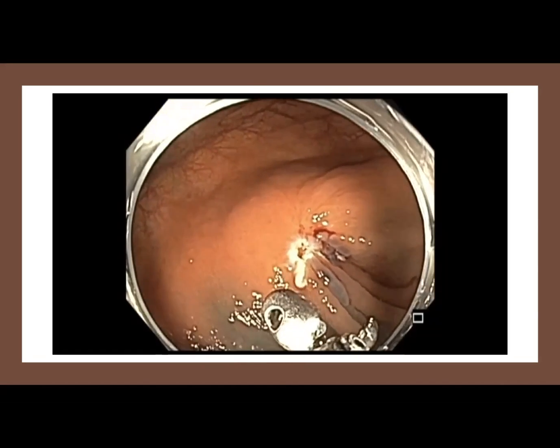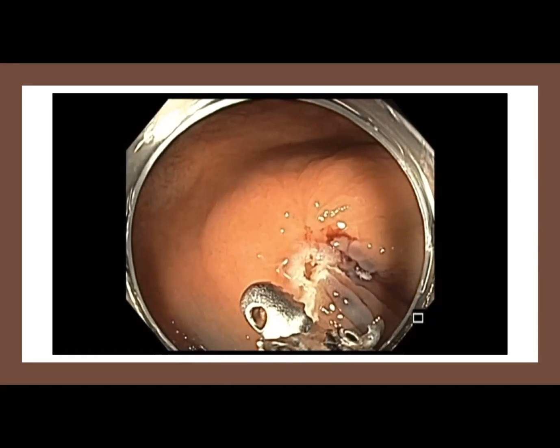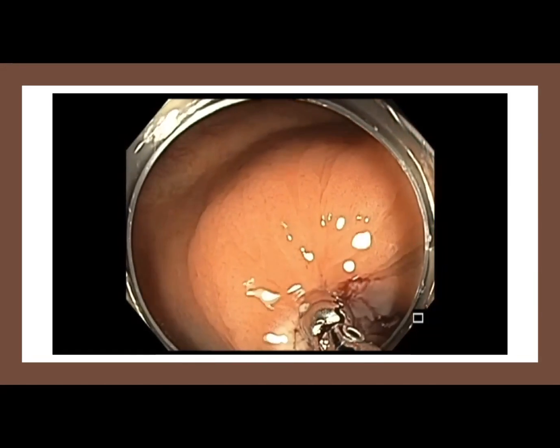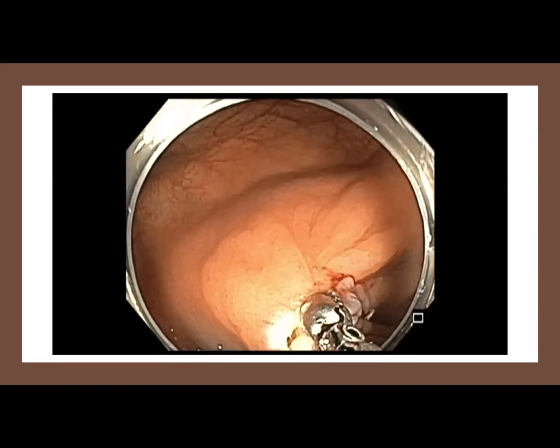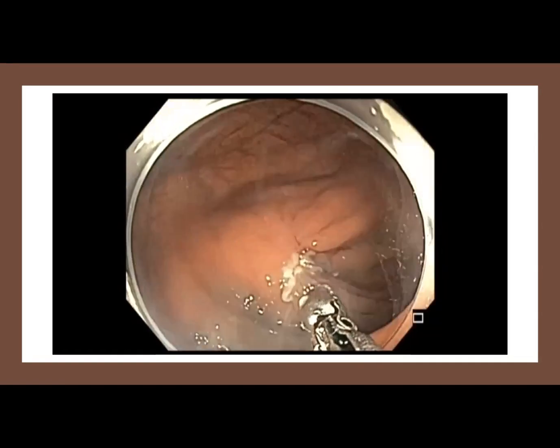What matters is your duration and your effect. So, these polyps, although they look small, when they have a tethered area like that, and you don't take care of it completely, they are likely to come back, and then it becomes a problem each time it comes back.